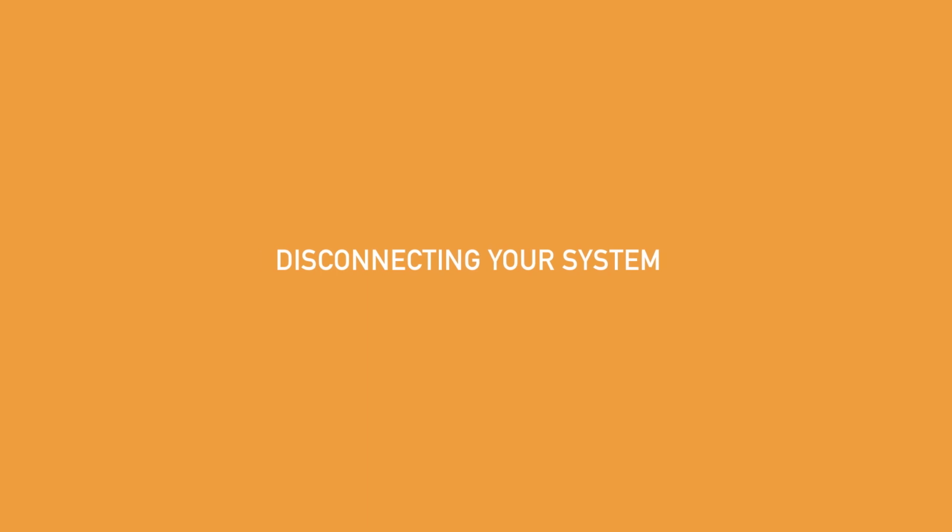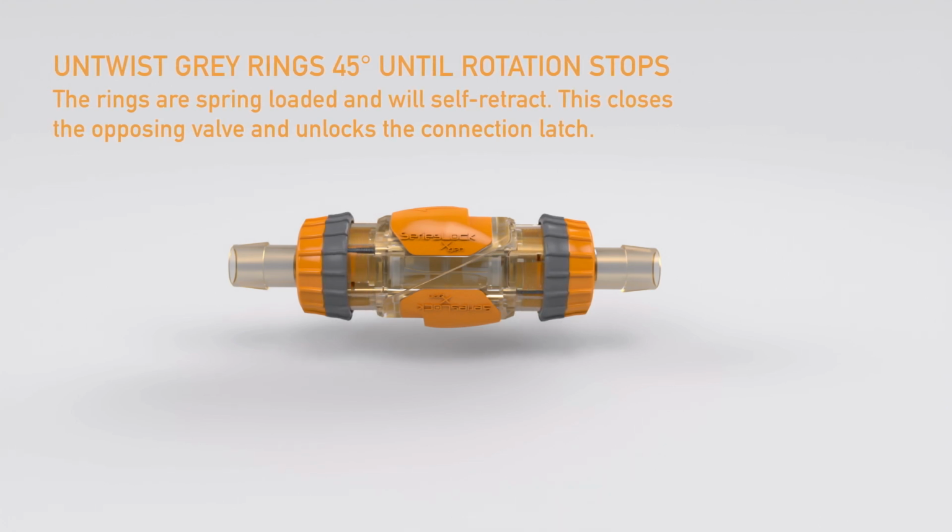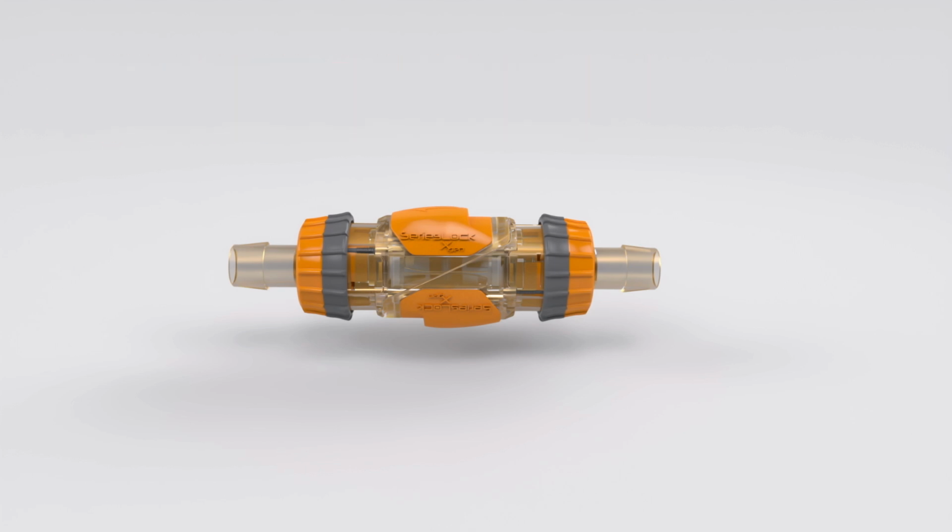When it's time to disconnect the SeriesLock Xgen, complete the process in reverse. Untwist the gray rings with a 45-degree rotation until rotation stops. If rotating both rings at the same time, each hand twists in opposite directions. The rings are spring-loaded and will return to their original position. This closes the valve and unlocks the orange rings and connection latches.